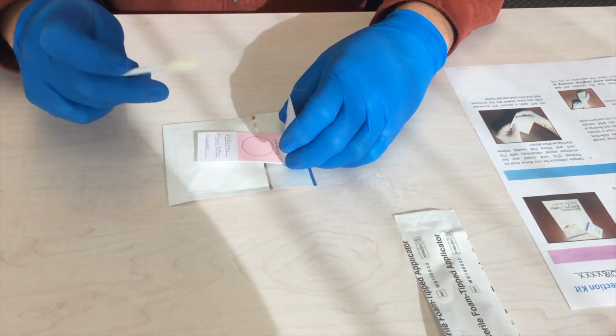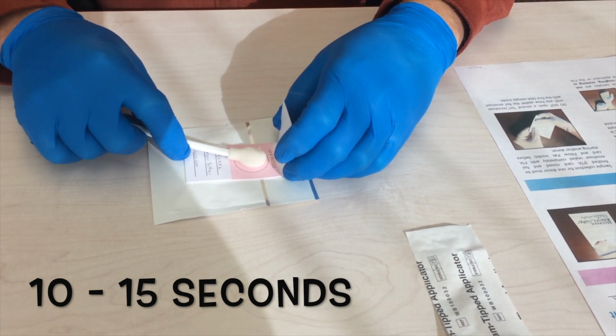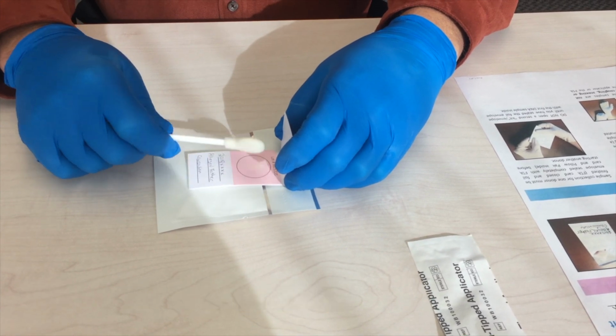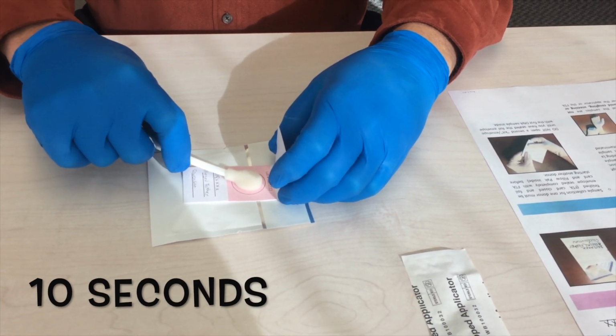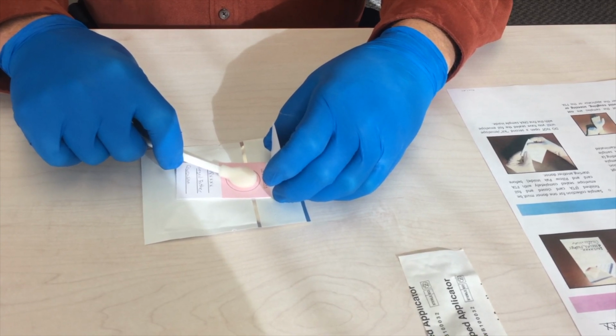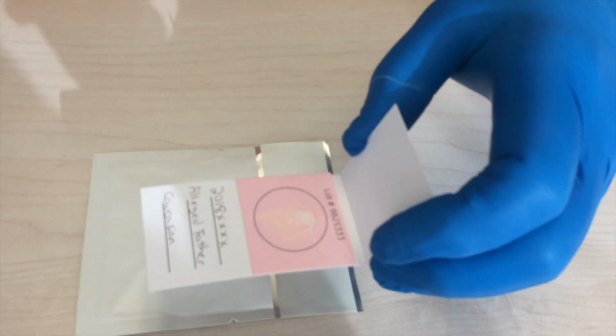Open the FTA sample card. Do not rub the foam swab on the card. Simply press one side of the foam swab down in the circle of the pink section of the FTA sample card for 10 to 15 seconds. Turn the foam swab over and press the other side down for roughly 10 seconds. Part of the circle must change from pink to white to indicate that the sample has been transferred.